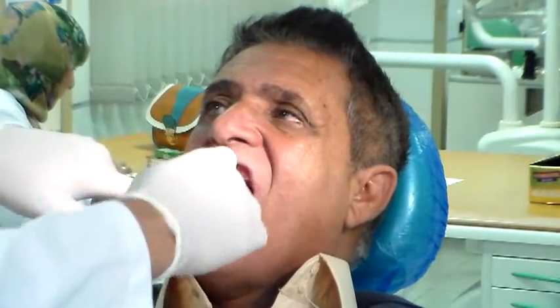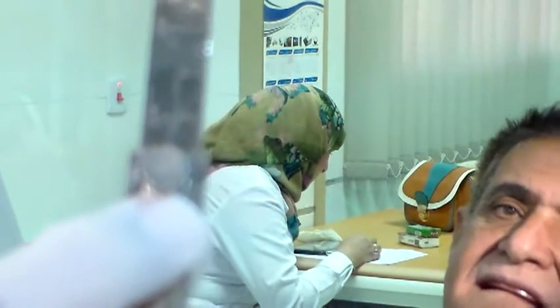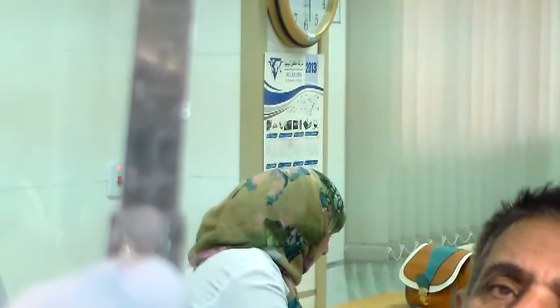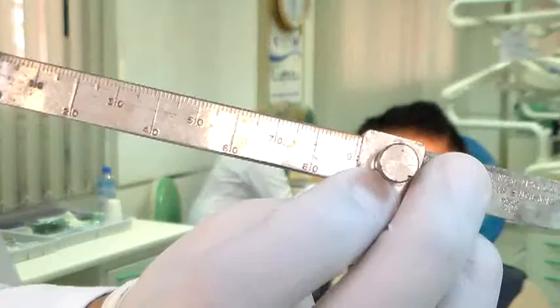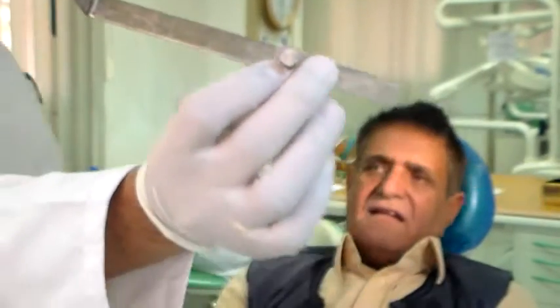Since I have not measured my vertical dimension at rest, I'm going to do that at this point. As I told you before, you fix the Willis gauge like this so that the readings on it can be seen. So you can see the readings on the Willis gauge, and I'm going to use this to measure the vertical dimension at rest.